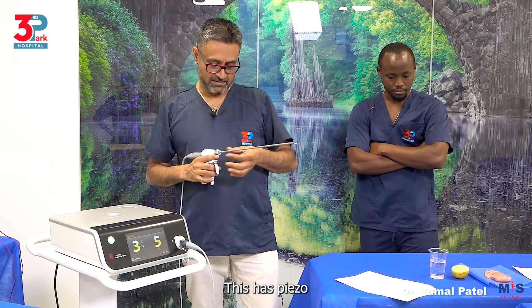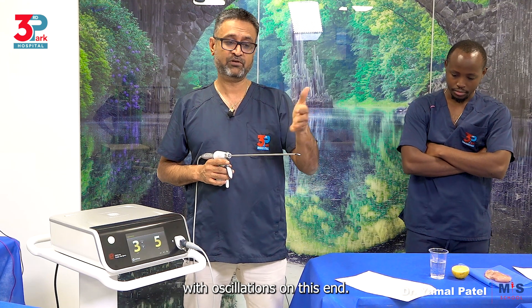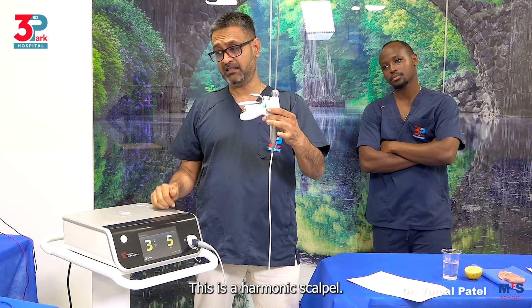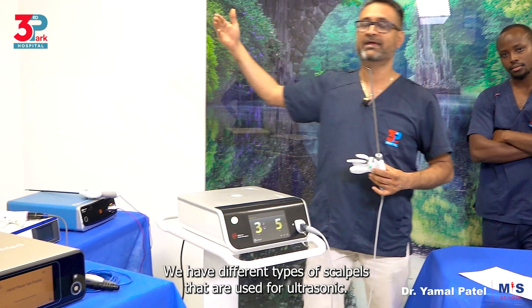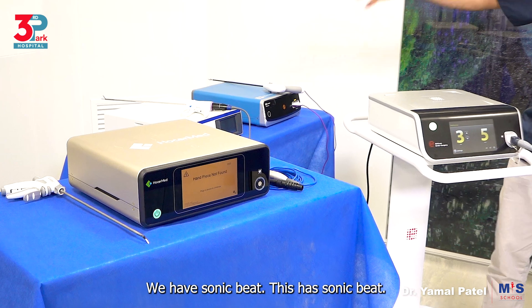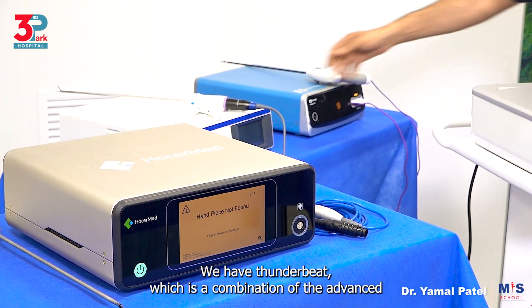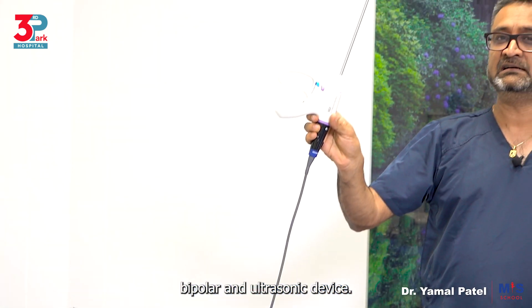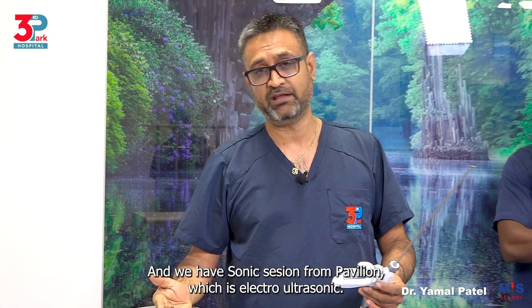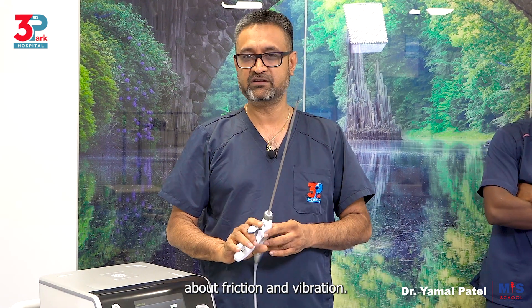This has piezoelectric crystals which actually help with oscillations at this end. So we have the handpiece — this is a harmonic scalpel. We have an eye scalpel. We have different types of scalpels used for ultrasonic. We have Sonic Beat, Thunder Beat which is a combination of advanced bipolar and ultrasonic, and Sonicision from Covidien which is ultrasonic. All these are options of ultrasonic, but they all work on the same principles of friction and vibration.